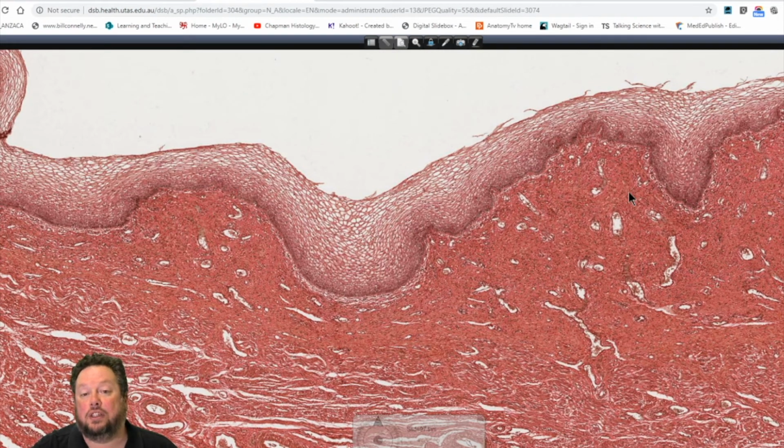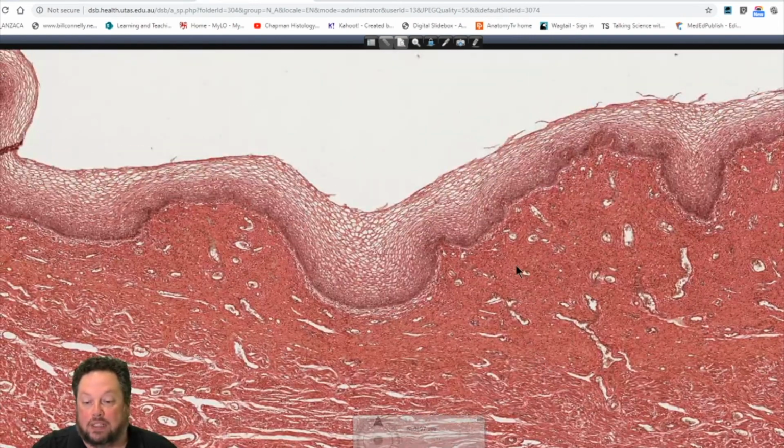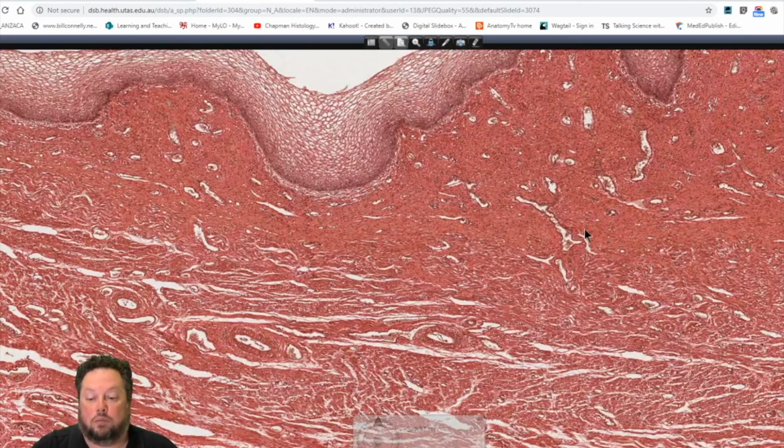There's also no glands in the vagina directly. Whereas the esophagus can have submucosal glands in the upper third and the distal third near the junction with the stomach. Any secretions that help lubricate the vagina come from the cervix or glands near the opening, the greater and lesser vestibular glands near the vestibule. So there are actually no secretory glands associated with the structure of the vagina. It doesn't have a submucosa. It immediately goes from a mucosa to a muscularis.